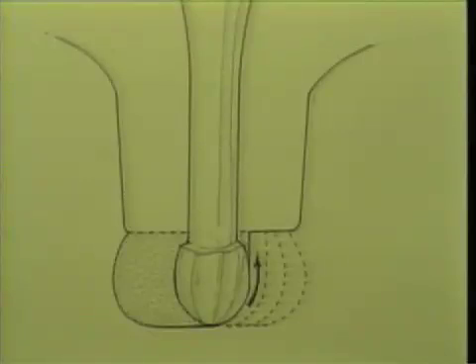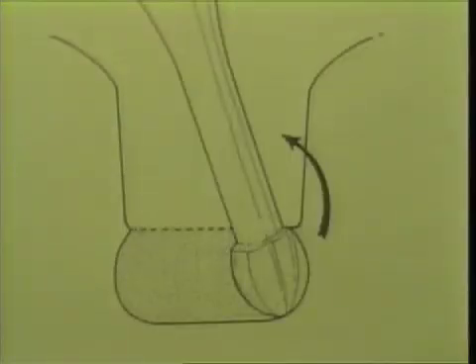After completing the buccal extension, the number two burr is placed into the original point and depth of penetration. The identical movements used for the buccal extension are now followed until the desired lingual extension is completed.